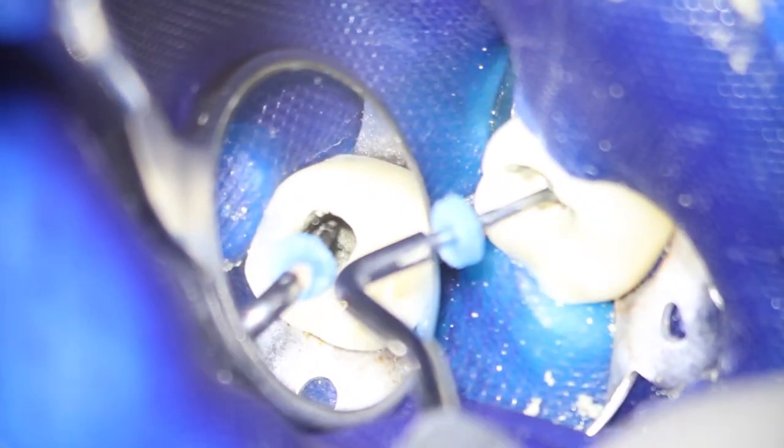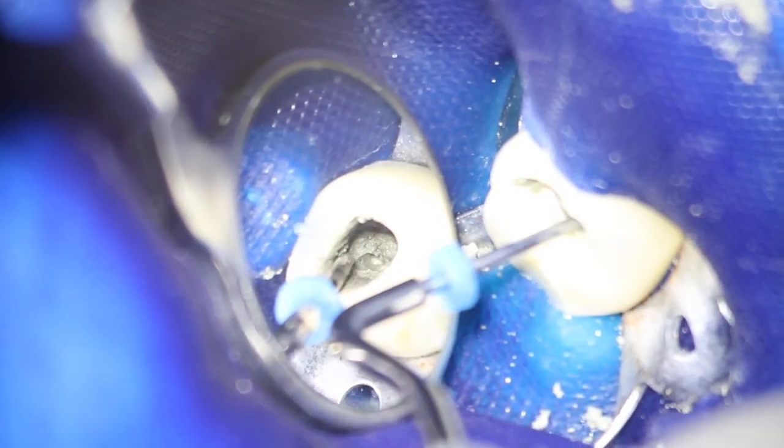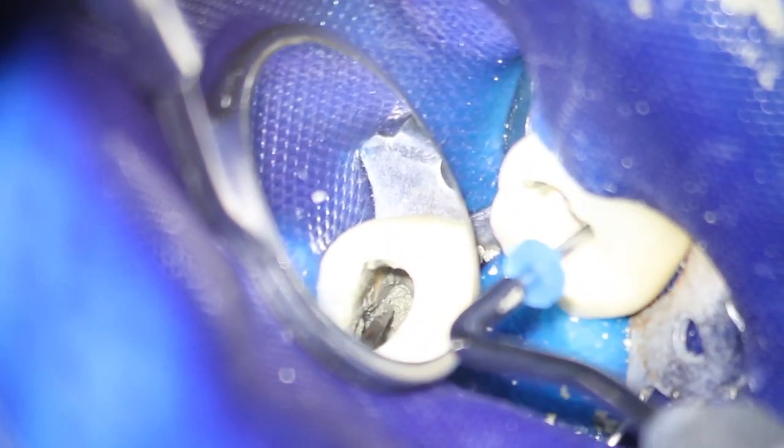In this way you are sure that every corner of the canal is filled with MTA properly. Now you can see how fluid the MTA becomes when you apply the ultrasound energy of your scaler.